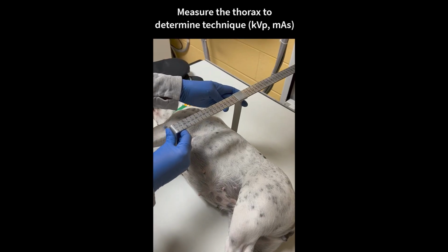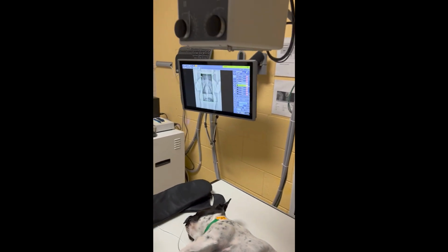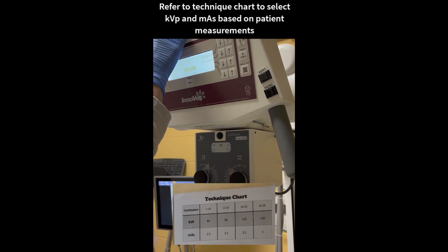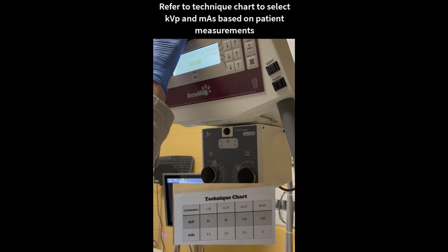The width of the thorax determines the exposure factors on a lateral radiograph, and height determines exposure factors for a ventrodorsal or dorsoventral view. Refer to the radiographic technique chart and set the kVp and mAs according to the relevant patient measurements.